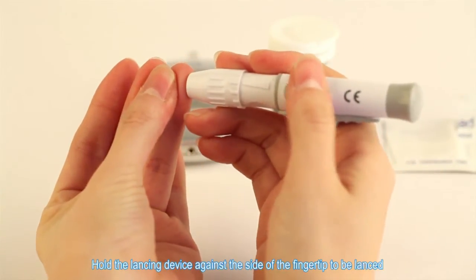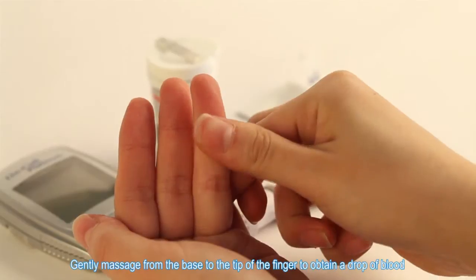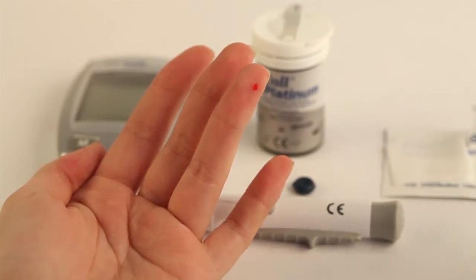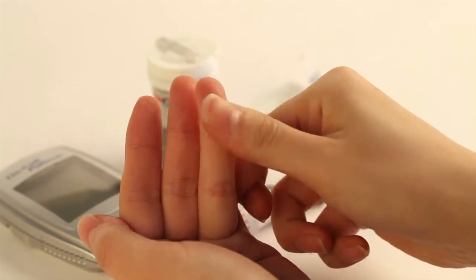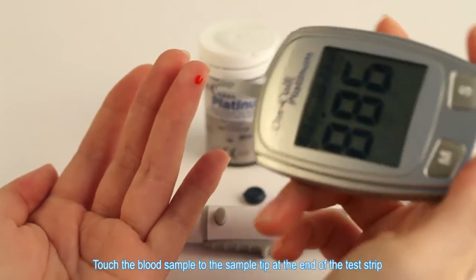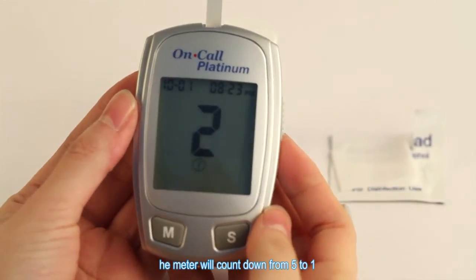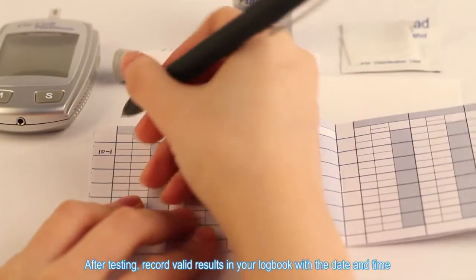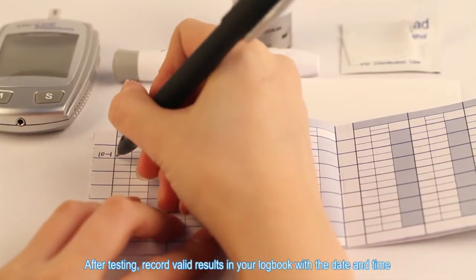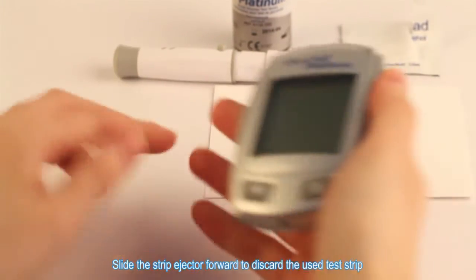Hold the lancing device against the side of the fingertip to be lanced. Push the release button to prick your fingertip. Gently massage from the base to the tip of the finger to obtain a drop of blood. Wipe away the first drop and obtain a second drop. Touch the blood sample to the sample tip at the end of the test strip. Once a sufficient sample has been applied, the meter will count down from 5 to 1 and then display the measurement result. After testing, record valid results in your logbook with the date and time and compare them to the target goals set by your diabetes healthcare provider. Slide the strip ejector forward to discard the used test strip.